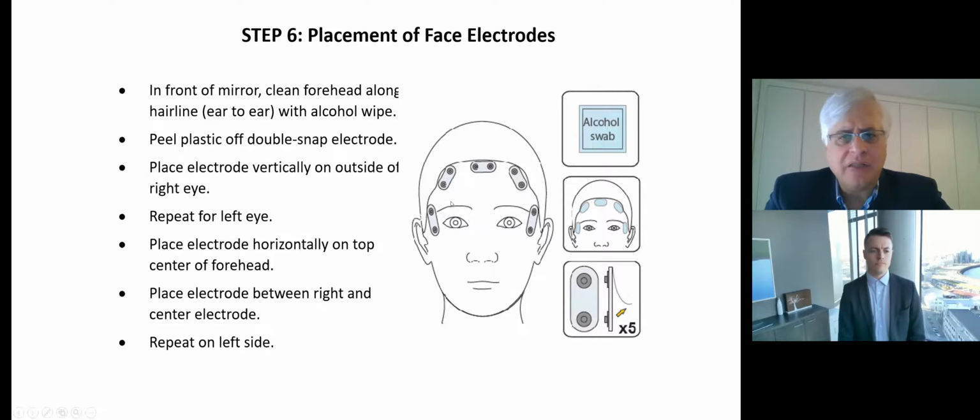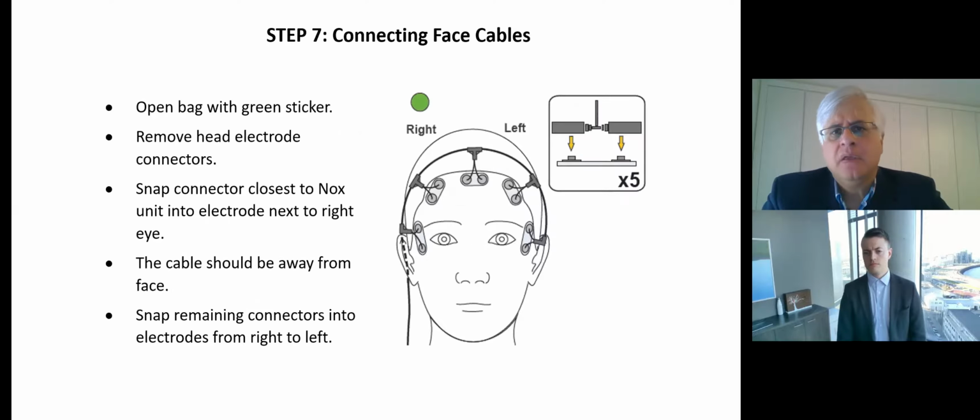And this is relatively simple. We do recommend that they be in front of a mirror, but it's not necessary. I think being in front of a mirror does help to place these electrodes in the right place. And then finally, clipping on that half a halo cable, which connects to the Nox A1 monitor, is relatively straightforward.